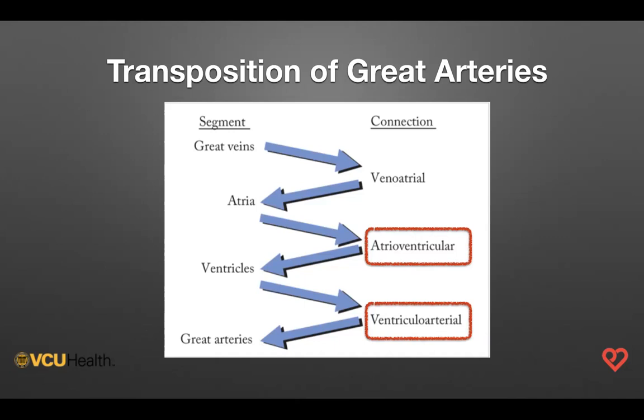How does the SVC, IVC connect to the atria? How do the pulmonary veins connect to the atria? How do the atria connect to the ventricles? That's the atrioventricular connection. How do the ventricles connect to the great arteries? What is the ventriculo-arterial connection?